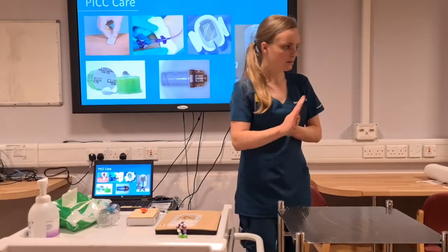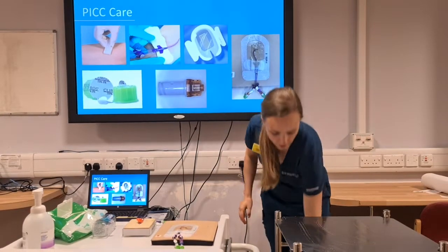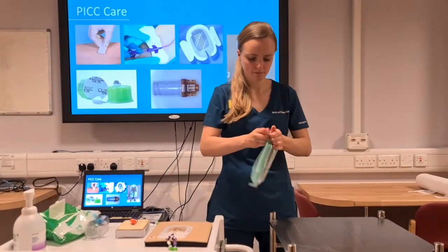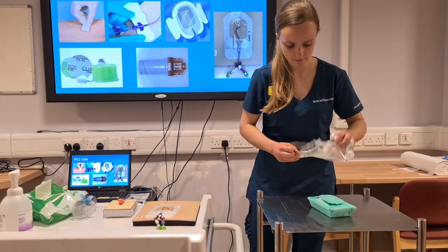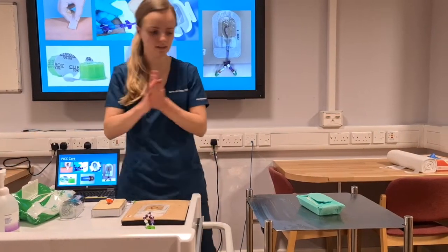I'm going to get all of my equipment ready, opening up my dressing pack. Placing that down there, decontaminating my hands.